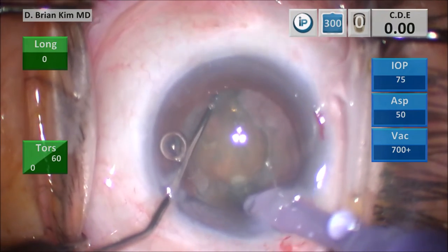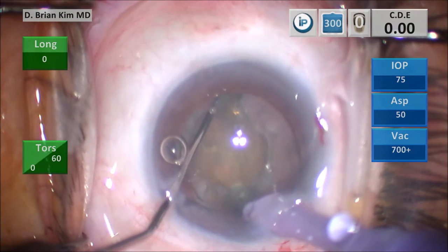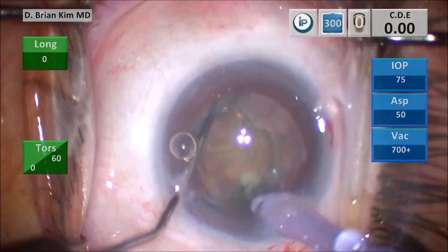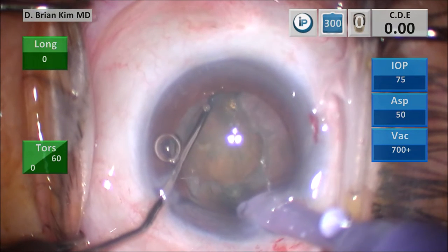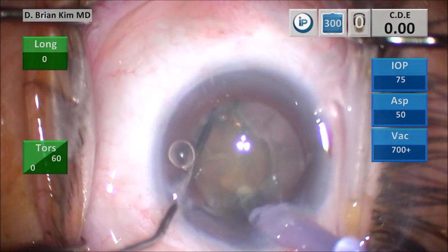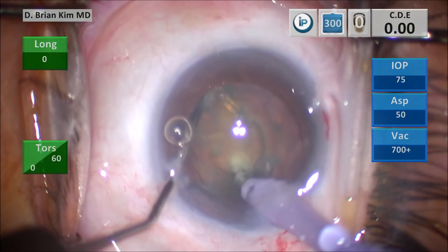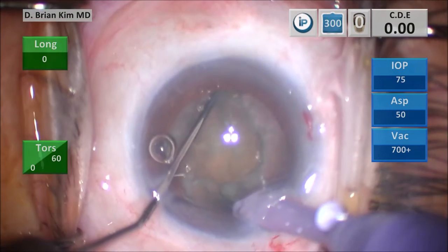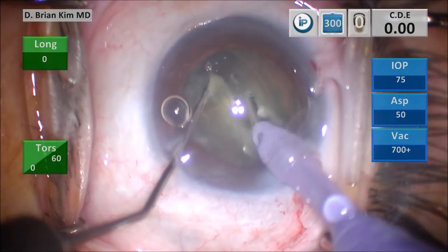You can see I'm also tilting and turning the phaco tip more into the horizontal position as both instruments come together. You can see the whitening of the lens material as it goes deeper and crushes the lens. As I feel in my fingers that the lens material is caught between the chopper and the phaco tip, I flatten it out and do the horizontal movement, crushing the lens material, and this bisects the lens in half.